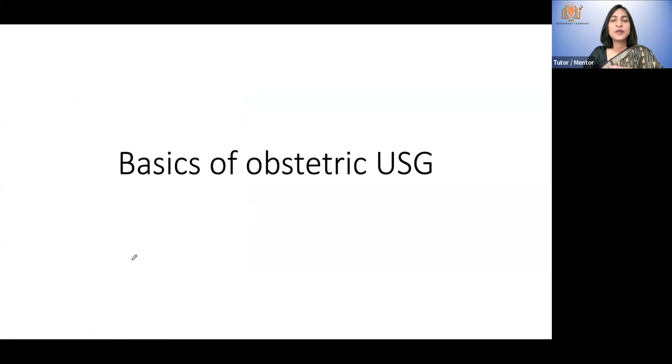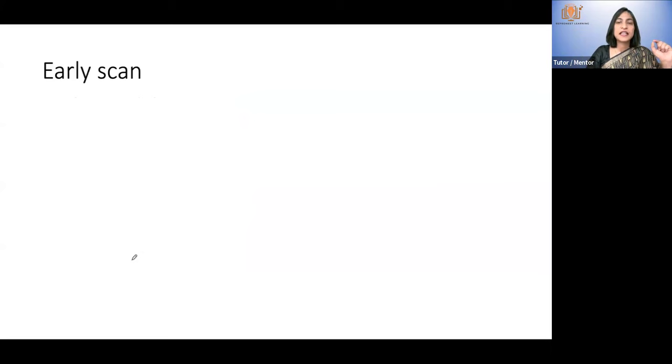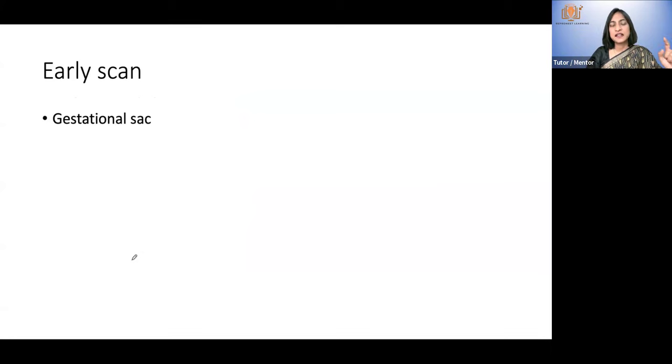This class is on basics of ultrasound and pregnancy. First we will see the basics of early pregnancy ultrasound. These are the following structures that you will see in an early pregnancy scan.